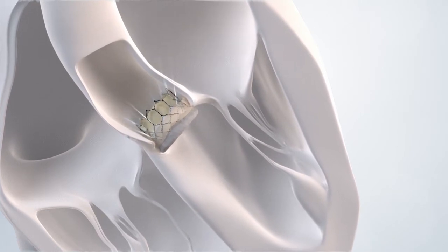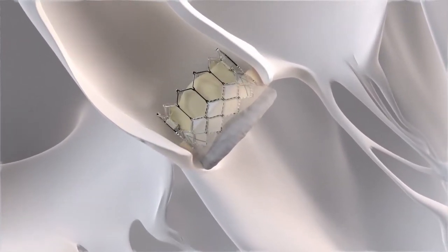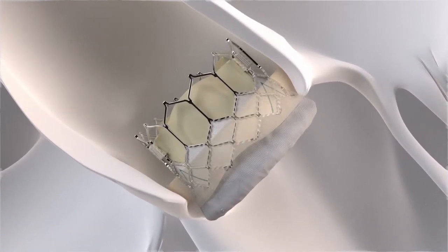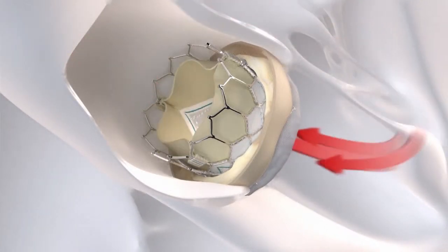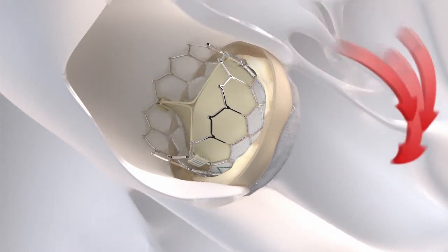The frame of the Edwards SAPIEN 3 transcatheter heart valve is strong and will use the calcified leaflets of your diseased valve to secure it in place. Once in place, the SAPIEN 3 valve begins functioning immediately, with the leaflets opening and closing to pump blood to the rest of your body.